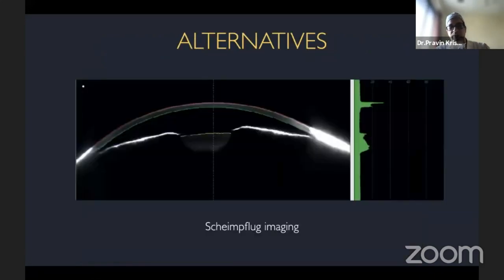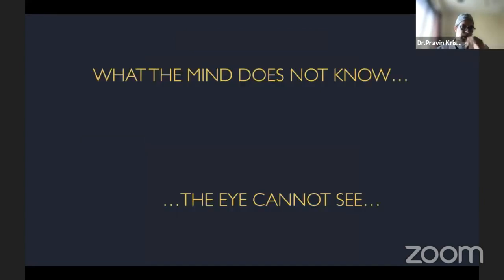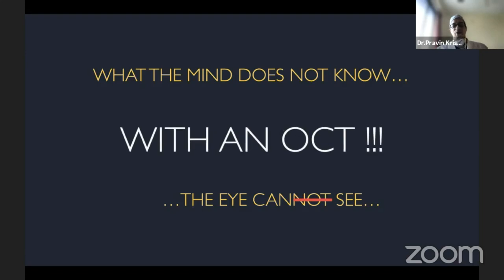There are alternatives like Scheimpflug. There are alternatives like the UBM and the Artemis, but none of them produce as high resolution images as the OCT. And what I would like to end with is "what the mind does not know, the eye cannot see," which is very commonly known. But actually, with the help of an OCT, you actually can see what the mind does not know. So thank you very much again.